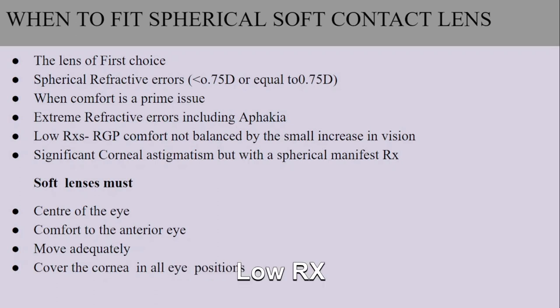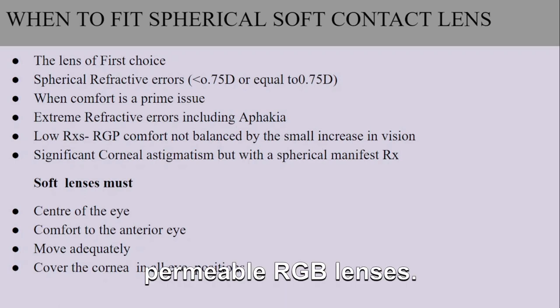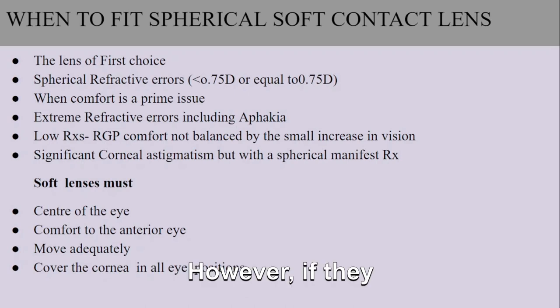Number 4. Low Rx and RGP comfort. In some cases, individuals may have low refractive errors that could be corrected with rigid gas permeable RGP lenses. However, if the increase in vision with RGP lenses is minimal or not balanced by a significant improvement in comfort, spherical soft contact lenses may be a preferable alternative.